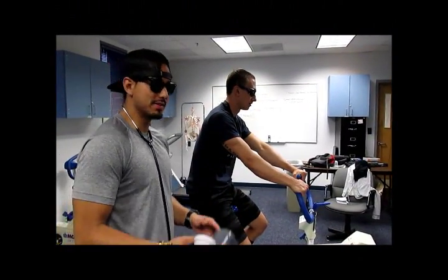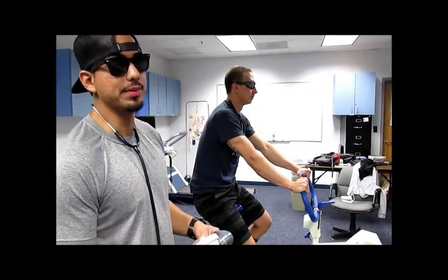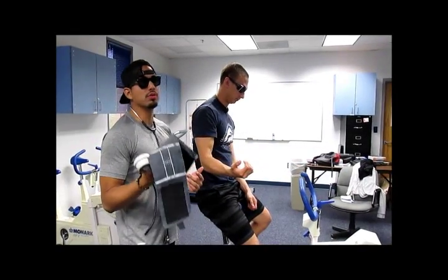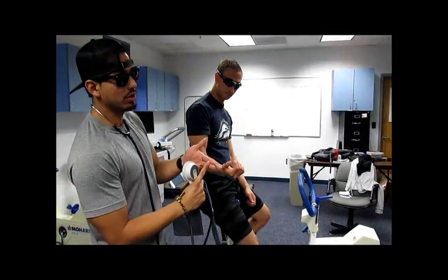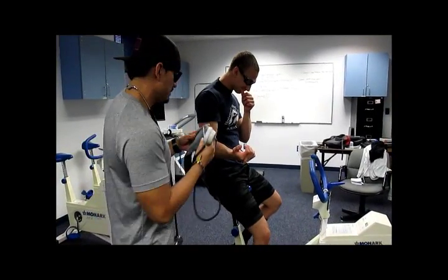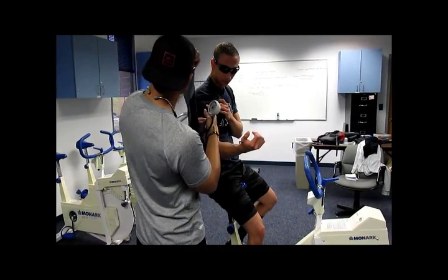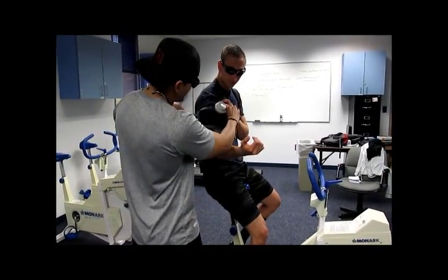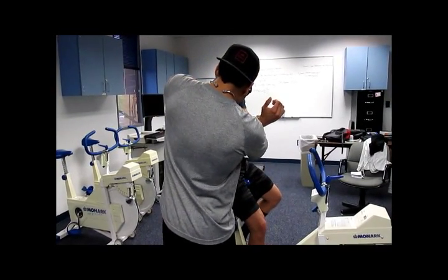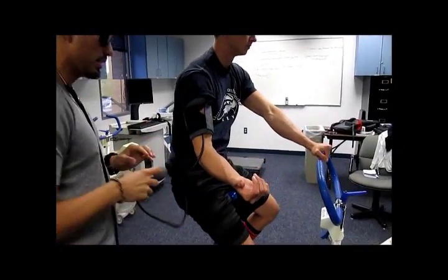Before beginning the test, it's very important to get the participant's resting blood pressure and resting heart rate. The cuff size we're going to use to measure his blood pressure is the regular adult. There's the child size, the regular adult, the large adult, and then the thigh blood pressure cuff. We're going to take the cuff, find the artery where it says artery, and match it up with his brachial artery, then take it around.